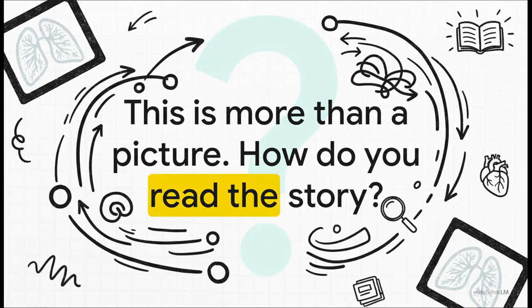See, this isn't just a static picture. It's a full-on narrative of what's happening inside someone's body. And yeah, it can be super intimidating, kind of like trying to read a language you don't know. So the big question is, how do you even start? Don't worry, we're going to crack that code together.